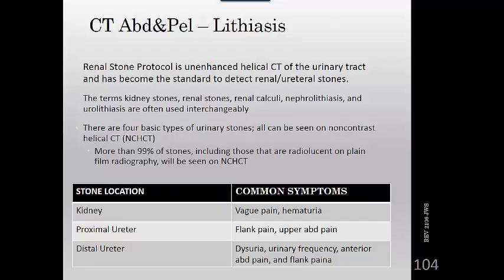The terms that we use, and you'll hear in scanning for renal stones, are kidney stones, renal stones, renal calculi, nephrolithiasis, and urolithiasis. Those are all used interchangeably now. So you may hear any of those, and for most of us in the medical field, those terms, renal stone or kidney stone, regardless of where it's located, is a kidney stone. But there are actually locations where they're called by where they're located. So anyway, we'll talk about that. Renal calculi in the urinary tract can cause extreme pain.